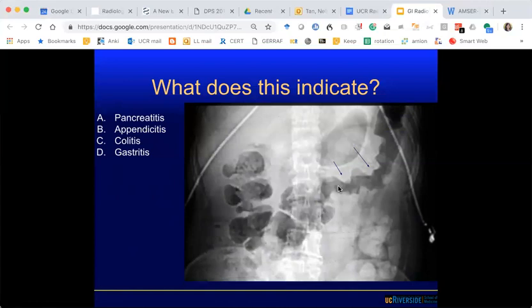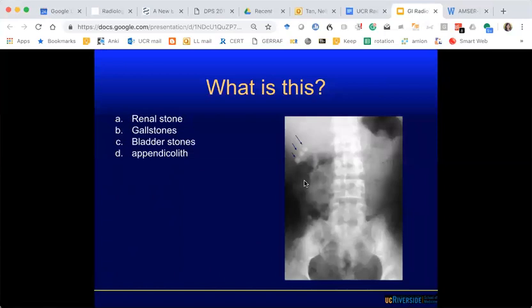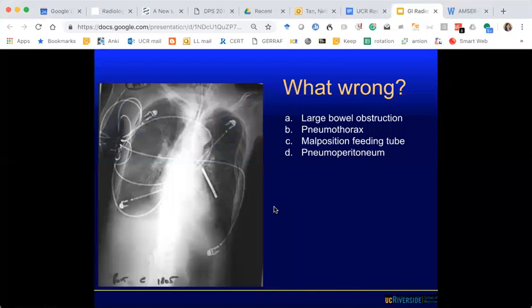What is this? You can see certain things on radiographs. The consensus is gallstones.